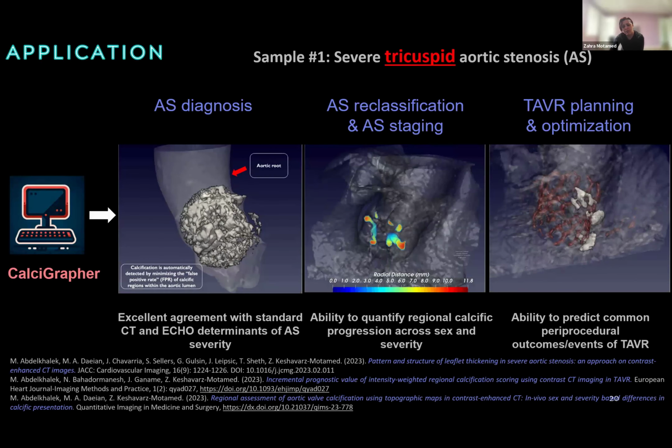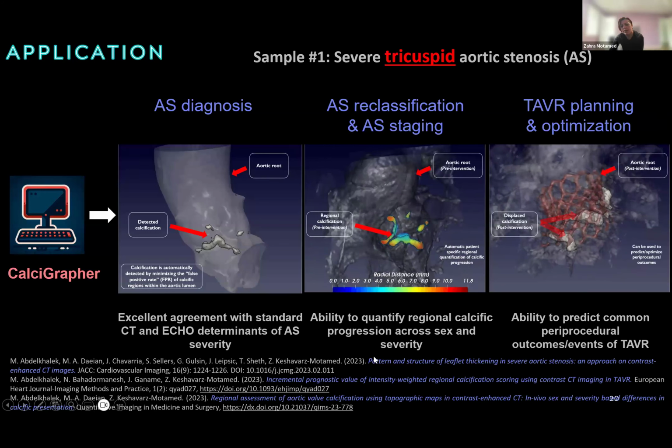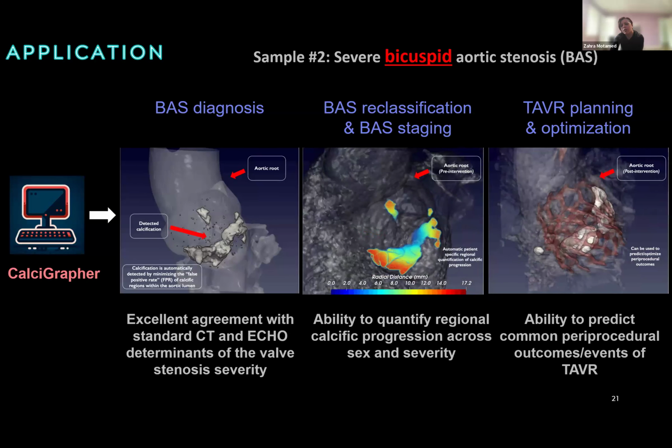With it we can quantify calcification pre-intervention and post-intervention. The case that you see here is for a tricuspid valve. In terms of geometry, any framework we develop for tricuspid is much easier, but we also extended the framework to the bicuspid aortic valve, so that we can quantify calcification pre-intervention and post-intervention. We now have a better understanding of the biomechanics of calcification, and that's all.